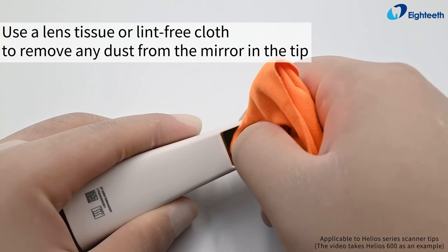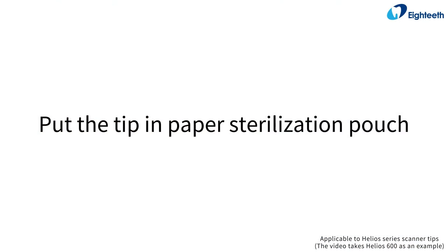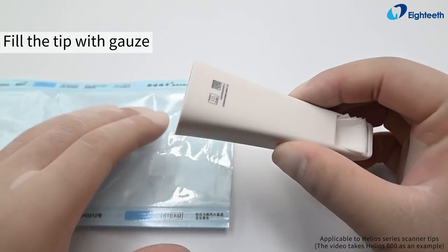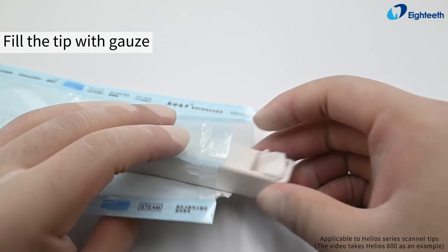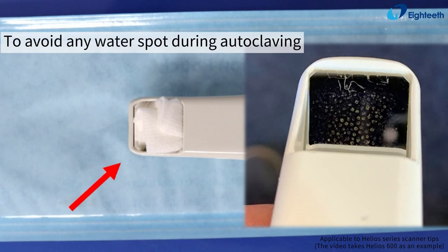Use a lens tissue or lint-free cloth to remove any dust from the mirror in the tip. Put the tip in a paper sterilization pouch and fill the tip with gauze to avoid any water spots during autoclaving.